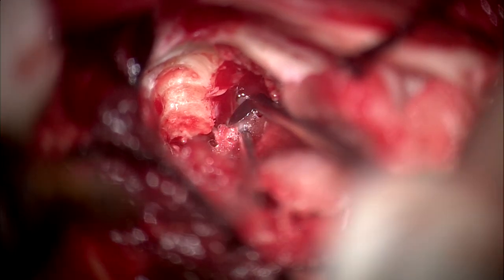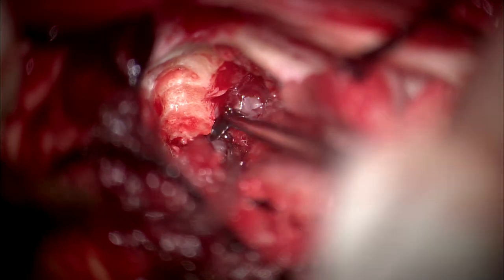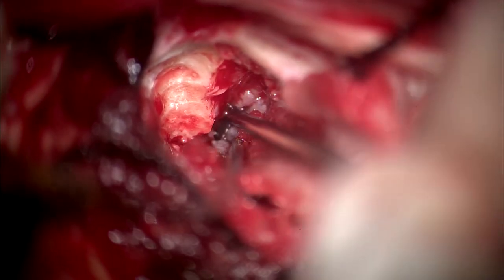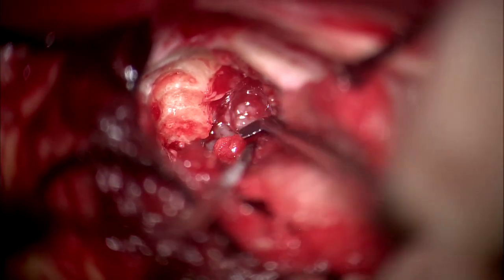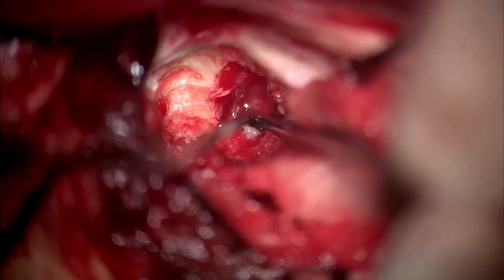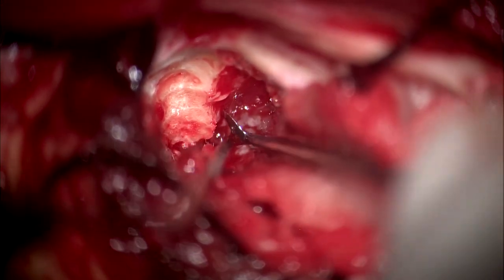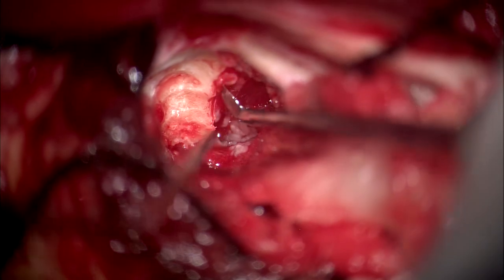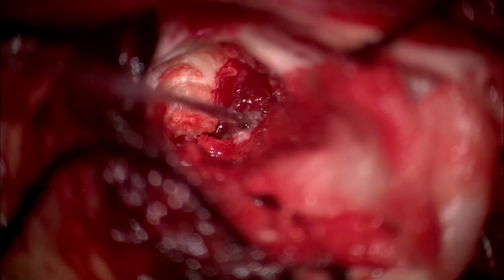That is my facial nerve there. Hello? Yes, sir, yes. That's the facial nerve there. Not properly. Yeah, no monitor you can see. We can see the tumor coming out. Facial nerve is there. Pressed anterosuperiorly. This is facial nerve. Hello? Yes, sir. Trying to see.